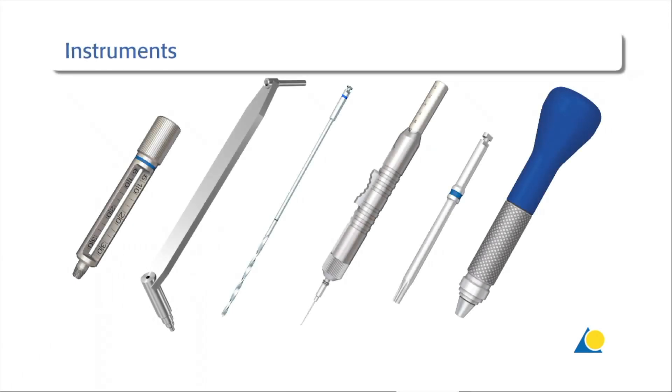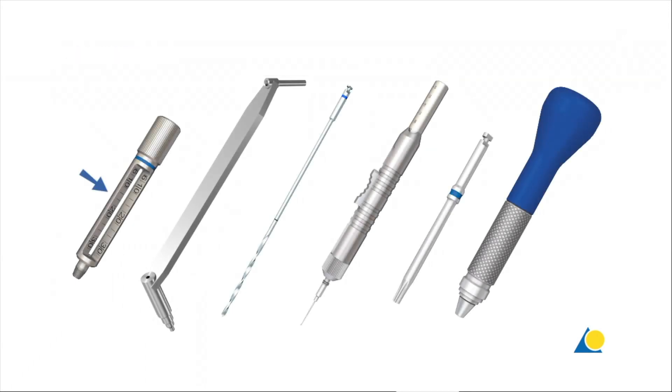The instruments needed are: the threaded 2.0 LCP drill sleeve, the 2.0 universal drill sleeve, the 1.5mm drill bit, the depth gauge, and the short star drive screwdriver shaft with handle.